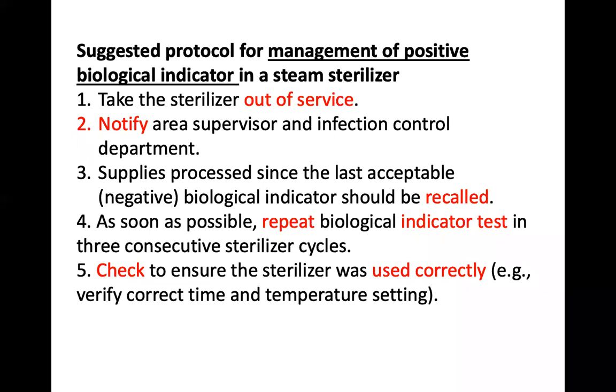So you want to stop using them, okay? So if you do not label well with the date and time, then you're going to be stuck. What is safe, what is not safe? So from the point of the biological indicator, take from the last acceptable negative biological indicator, recall, okay? In case of an outbreak investigation, from the time you notice that there's a problem and you're working backwards also, recall them based on the date and time.